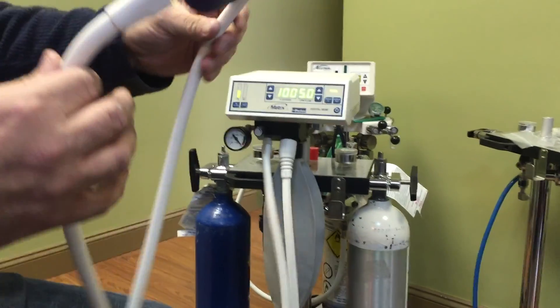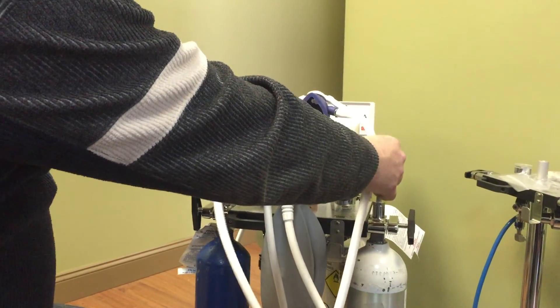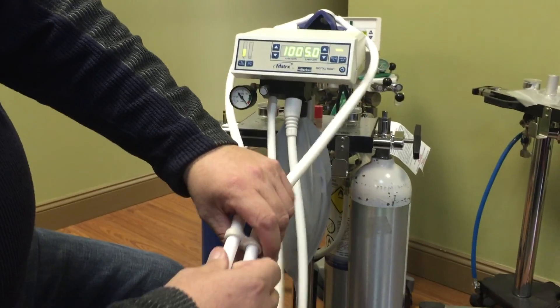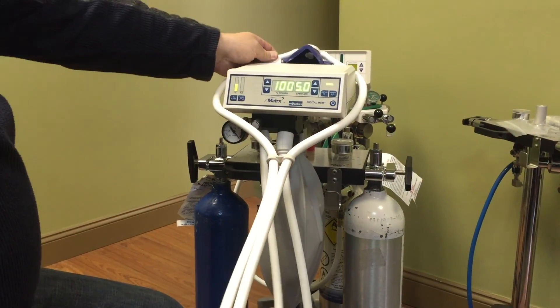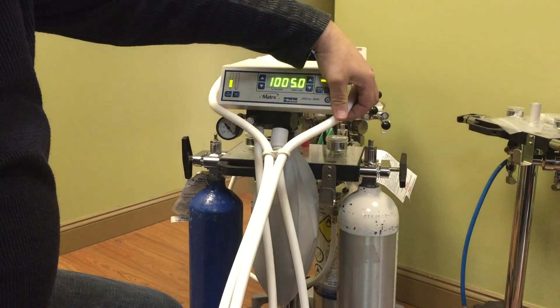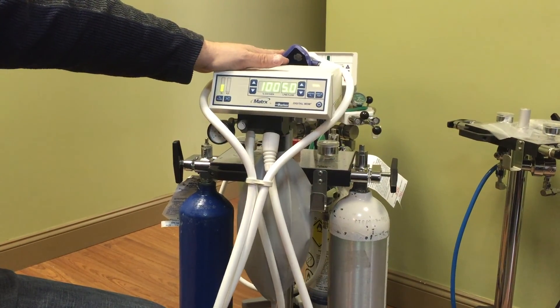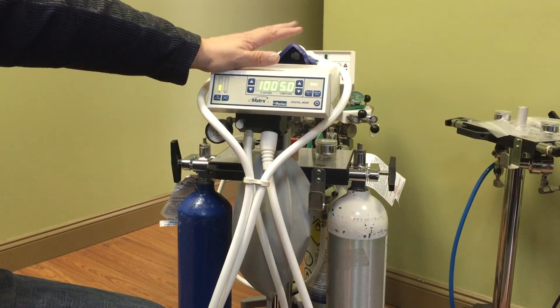When putting this on the patient's face, you're going to slide it up on the patient like this, run these tubes in the back of the headrest of the chair, and just tighten that up like this. That's how you hold it on the patient's face. Now, you've got to make sure your nasal hood is not oversized. We have three sizes: pedo, medium, and large.